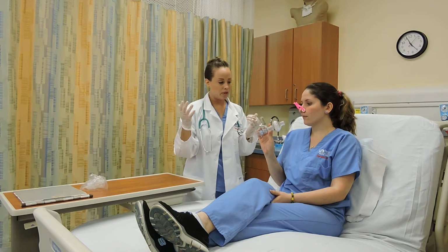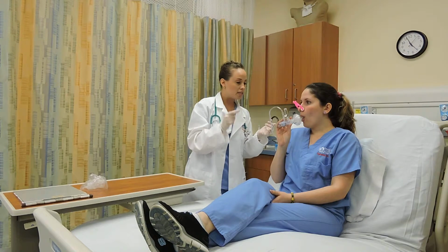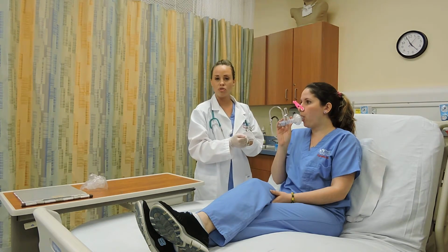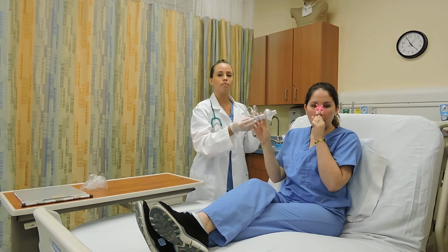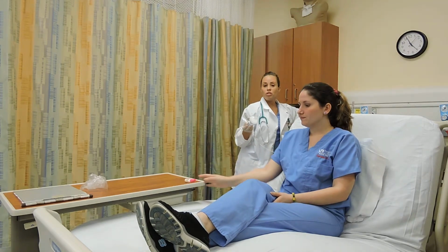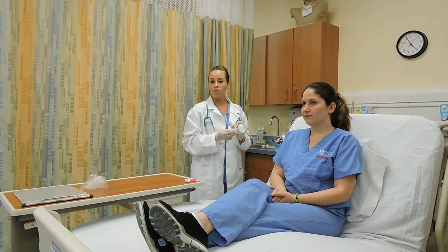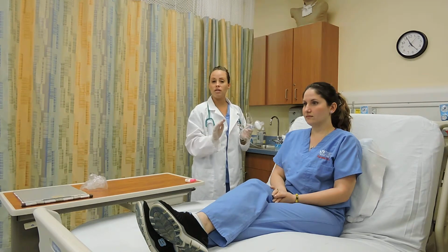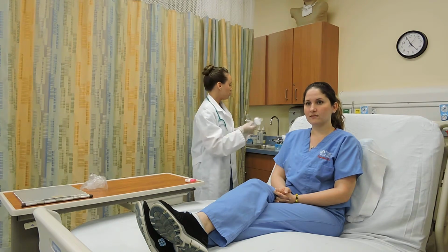Okay? Here we go. Tight seal around. Inhale and exhale actively. 10 to 20, a little more. 10 to 20 centimeters of water. Good duration of exhalation. Good job. 2 half coughs. Very good. Very important to let your patient know that this cycle is to be repeated 4 to 8 times during a 10 to 20 minute session. All right? And if there is any expectoration, note sputum for quantity, viscosity, odor, and color. Okay?